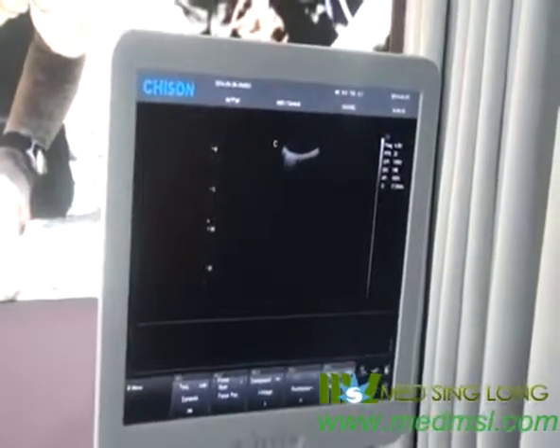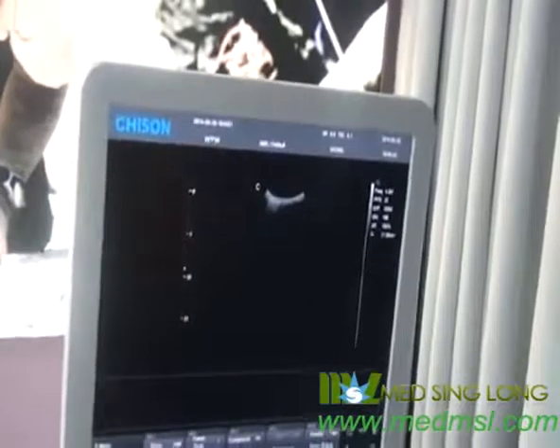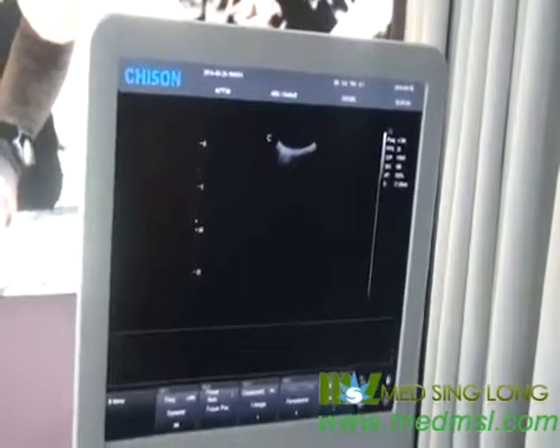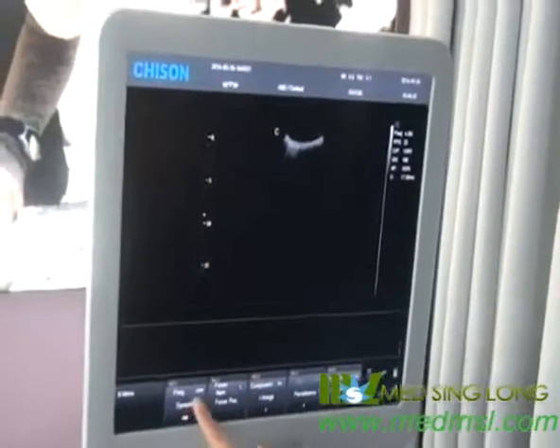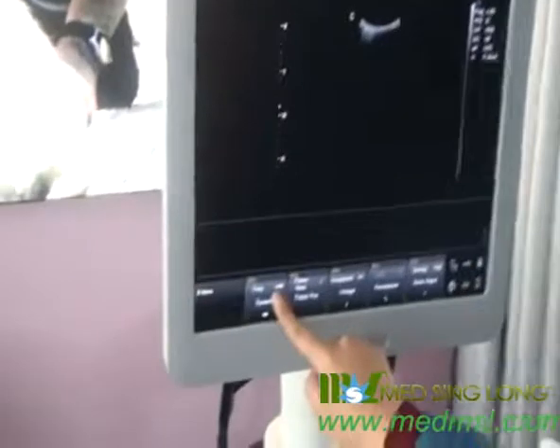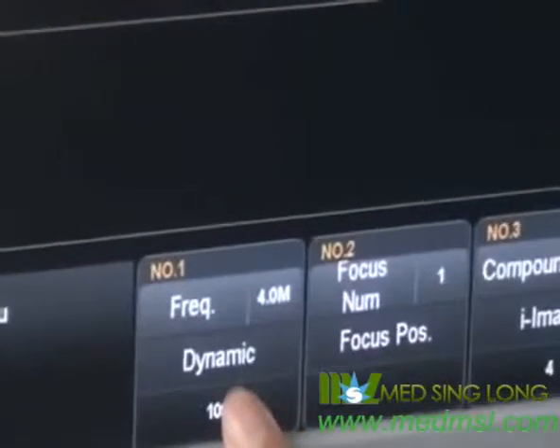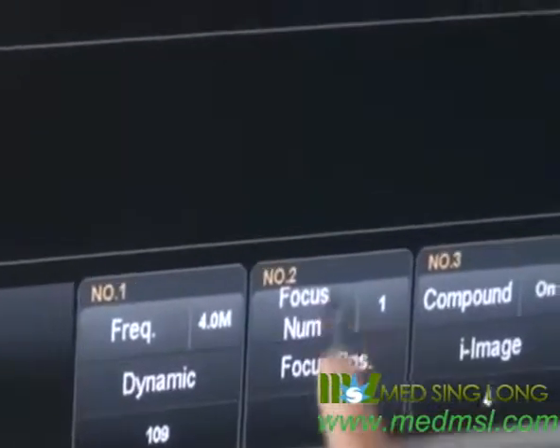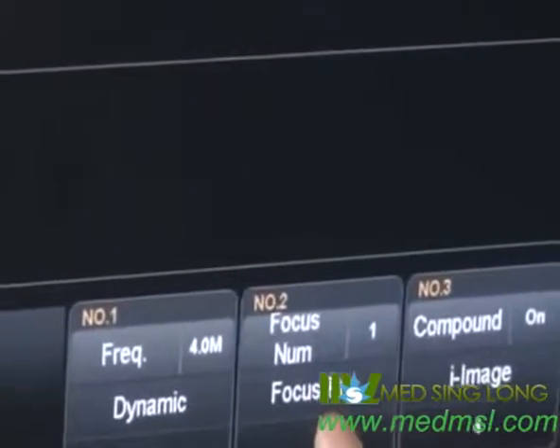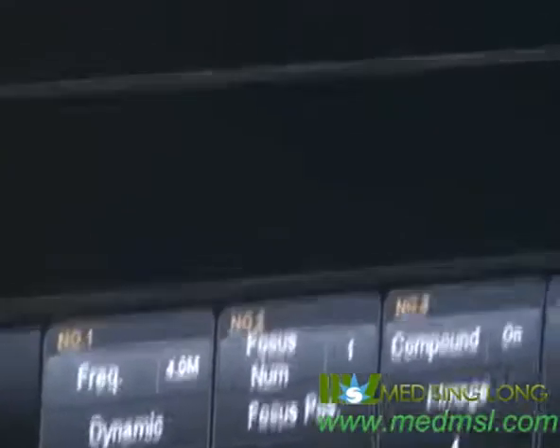In B mode, we have many parameters to adjust. The most important are frequency, dynamic, focus number and focus position, depth, and gain.